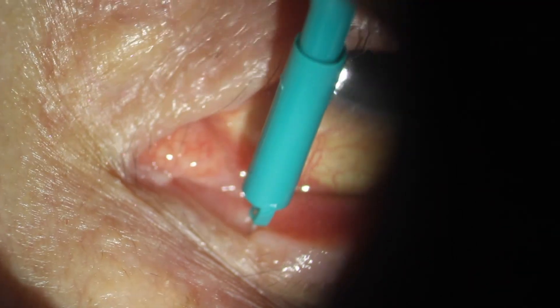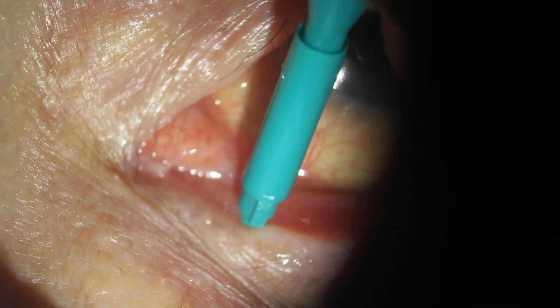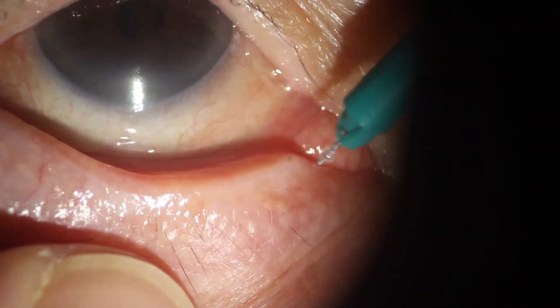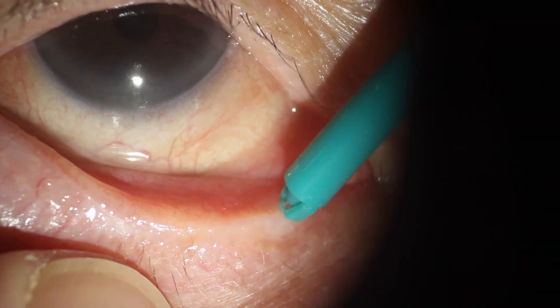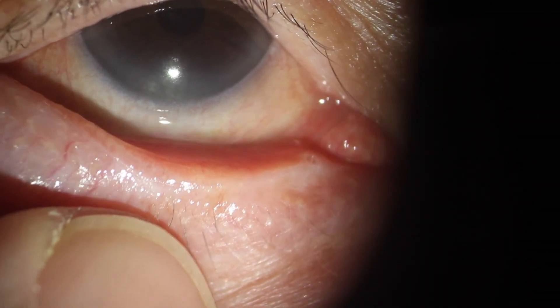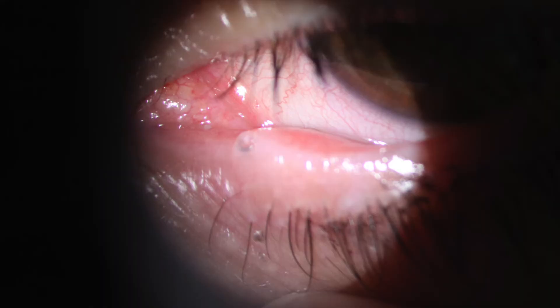These are called a Painless Plug, distributed by Spectrum Surgical in Australia. It just goes vertically into the canaliculus — again, local anaesthetic in the eye only — and sits there. A little cap is visible above the punctum. I normally try dissolving plugs first to see if they work and then consider the permanent plugs, as they're more expensive. Quick and very easy to insert for optometrists — no other equipment is required.